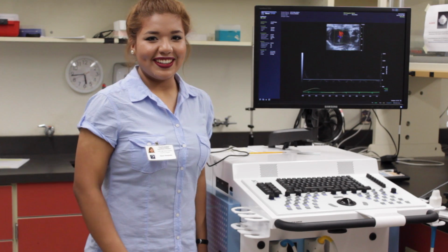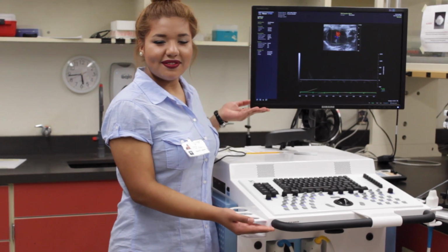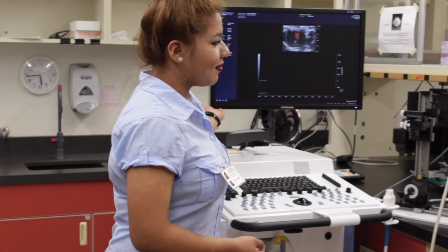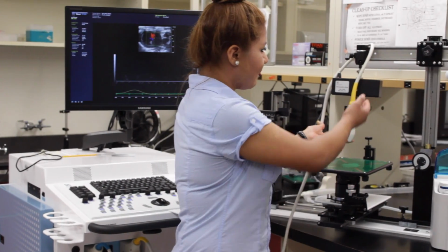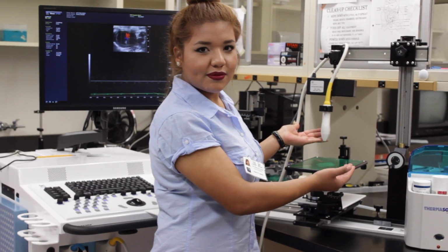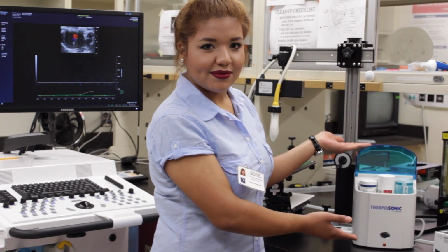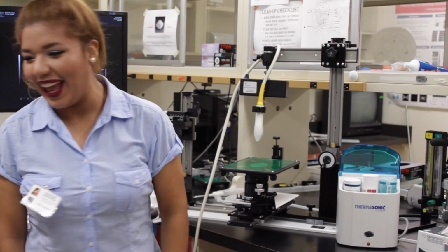In this particular process, the tools you will need will include a cardiac ultrasound machine with computer and software to interpret the imaging, a probe with appropriate frequency for the size of the patient, gurney or bed, water-based lubricating ultrasound gel, and of course, a patient.